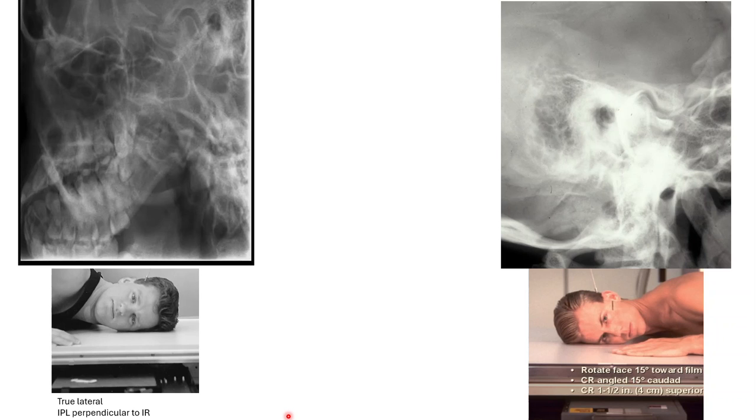Hello, welcome back. This video is for radiologic technology students to learn the radiographic criteria and positioning of temporomandibular joints.